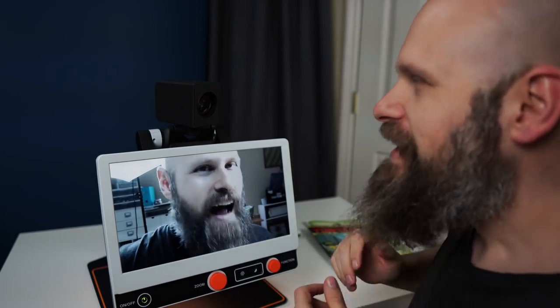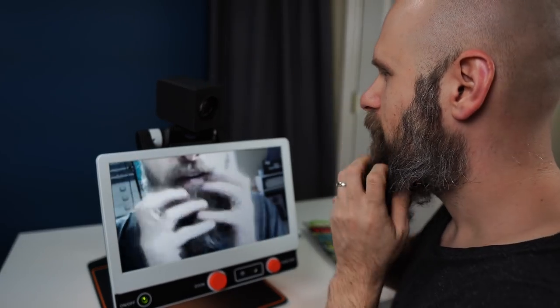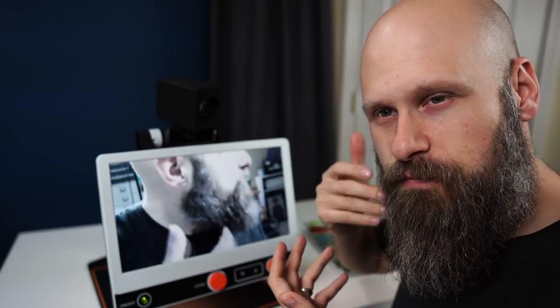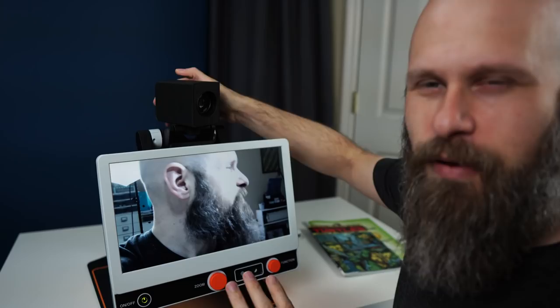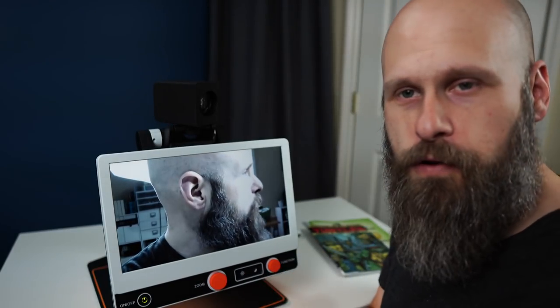We can even point the camera at ourselves. So I could use this to trim up my beard — which I actually do need to. I can angle it down a little bit. Someone could use this for putting on makeup, brushing their hair — tons of possibilities.